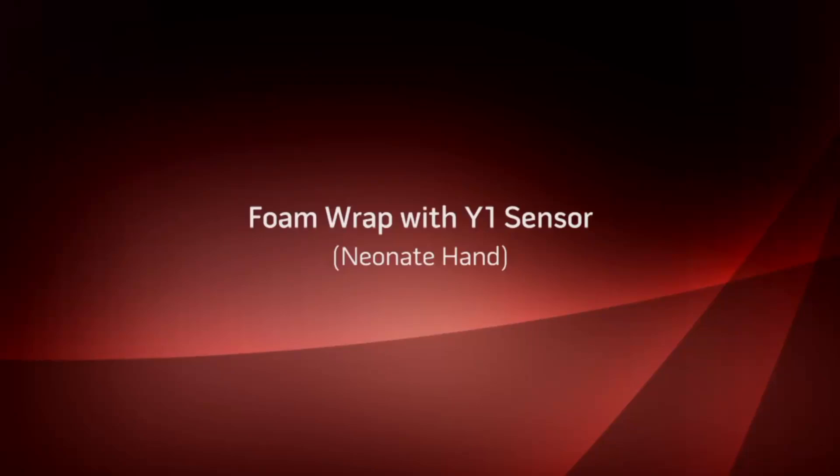I will now demonstrate the application of the Y1 sensor utilizing a foam wrap to the hand of a neonatal patient.